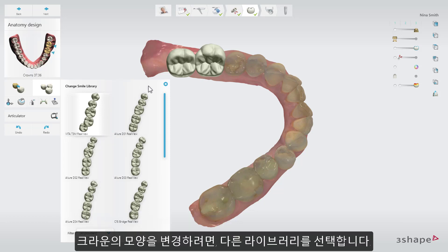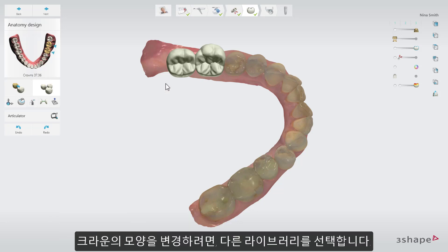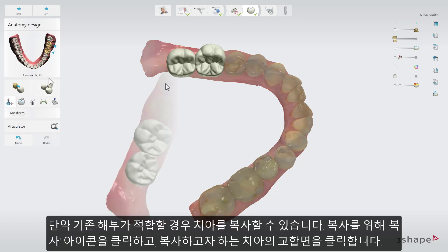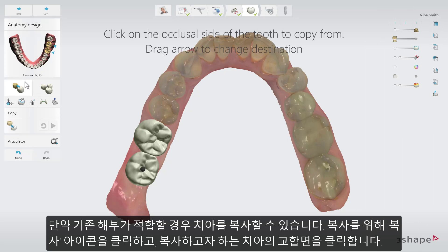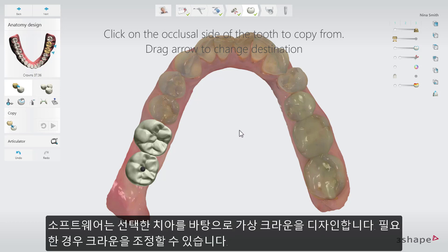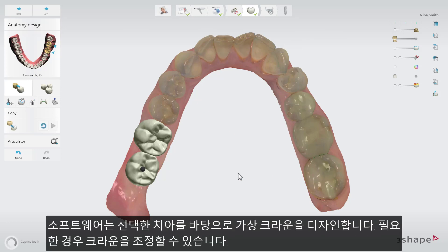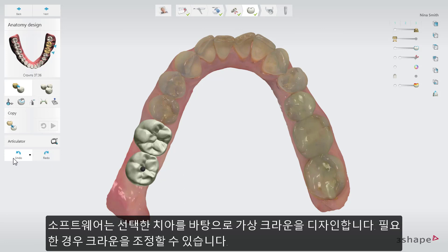To change the shape of the crown, you can select another library. You can also choose to copy a tooth if the existing anatomy is suitable. Click on the Copy icon, then click on the occlusal side of the tooth you wish to copy. The software will design the virtual crown based on the tooth you chose. You can adjust the crown if needed.